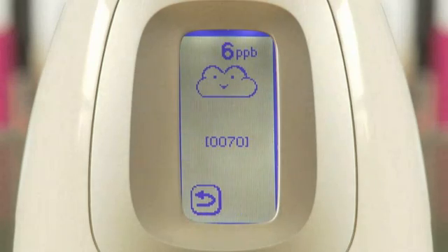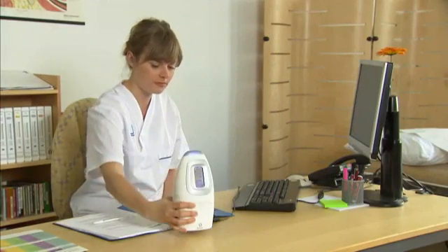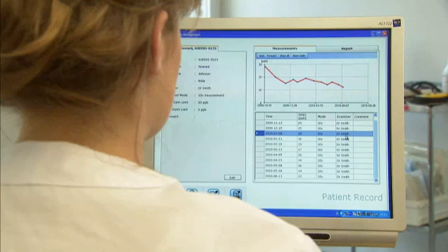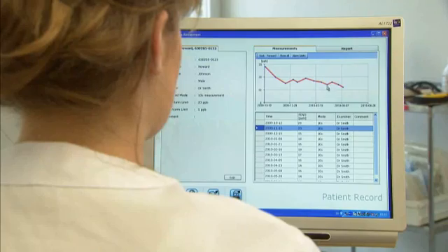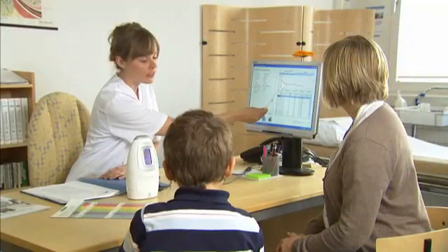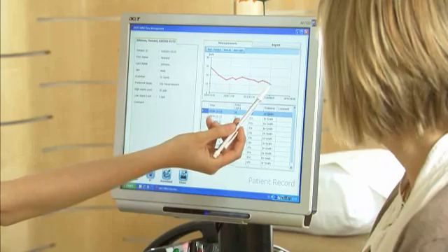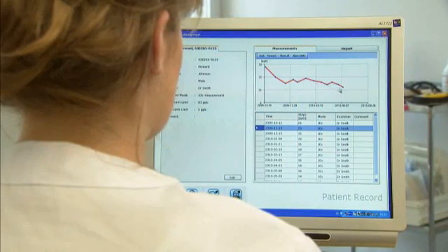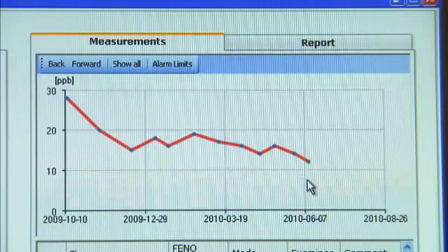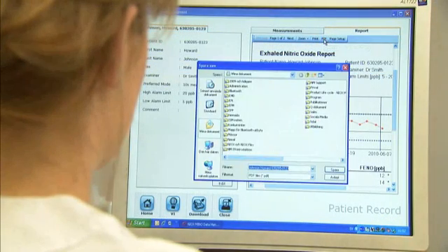All test results are stored in the NIOX MINO instrument and can be transferred to a PC at any time for secure documentation and patient data storage. With NIOX MINO data management software on your computer, it's possible to have a graphical representation of historical patient data and create printed reports or PDF files.